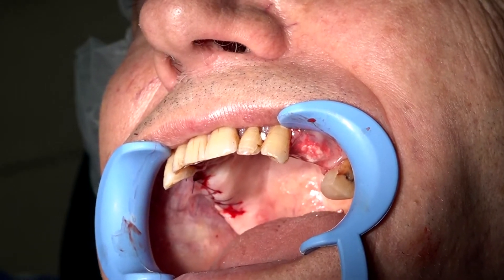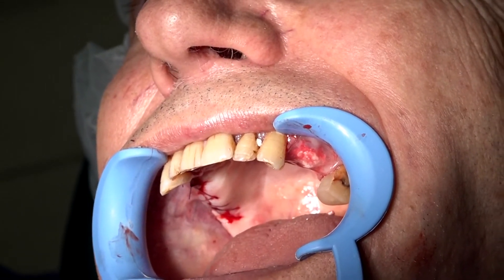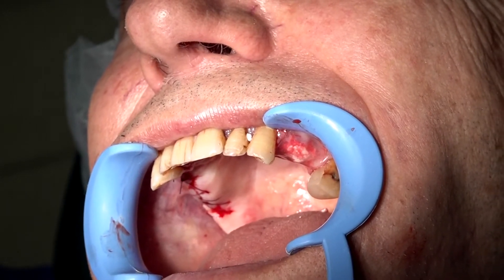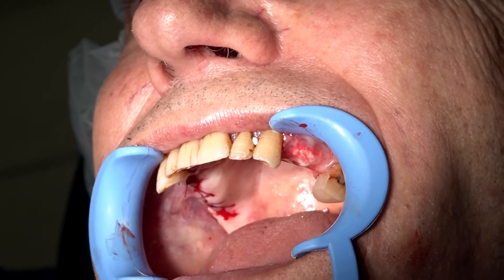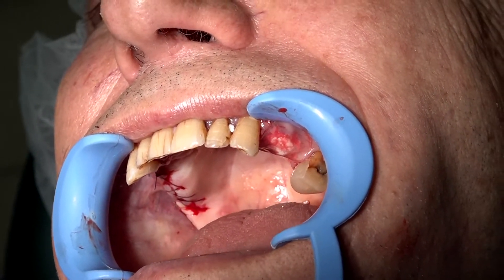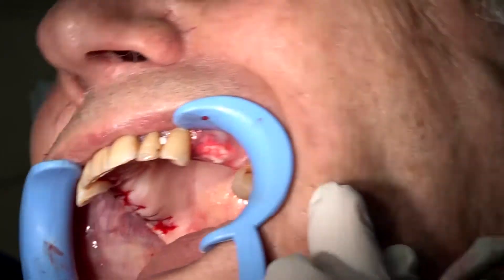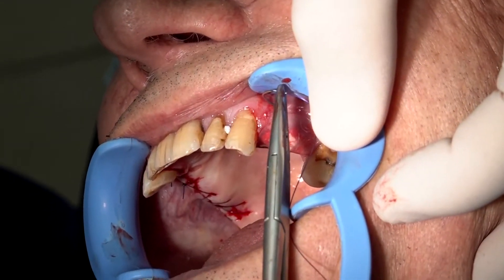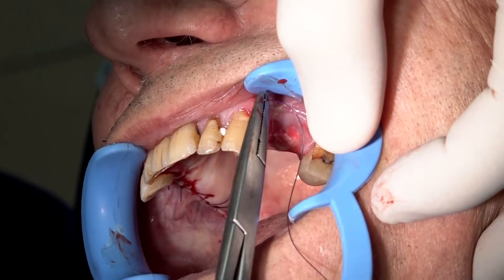However, with sutures, it can stay there about 10 to 14 days until it absorbs completely. The technique for suturing is very simple. We are performing a simple mattress suture, going from one side to the other underneath the band.